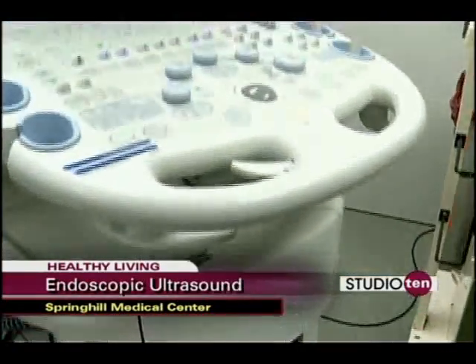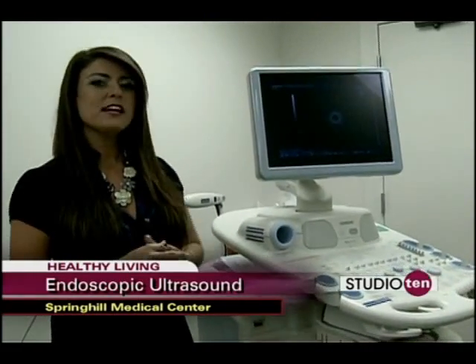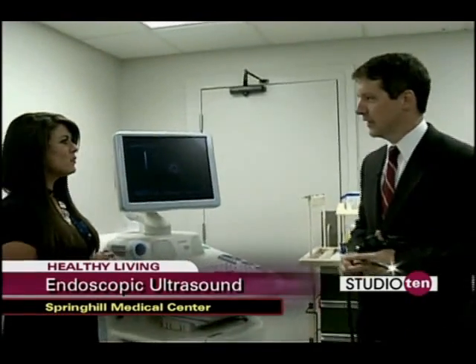This elaborate piece of equipment you're looking at is the newest type of endoscopic equipment at Springhill Medical Center. It's called EUS, or endoscopic ultrasound, and today we're with Dr. Michael Sanders to explain exactly what this does. Thank you for having us.